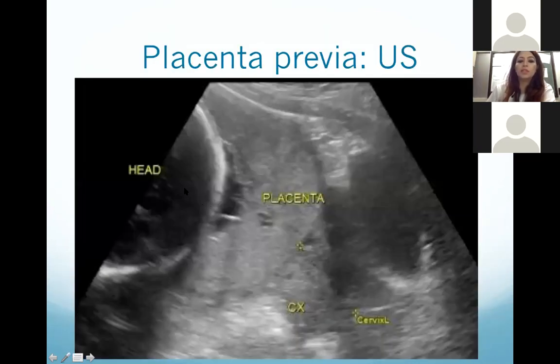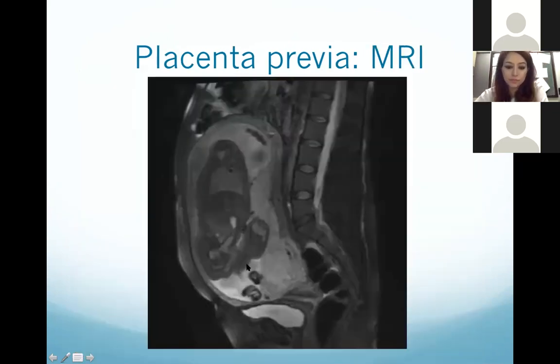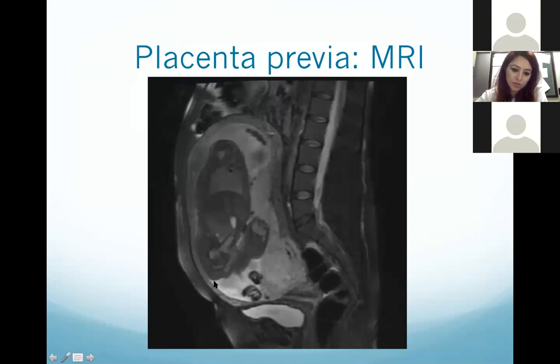Here you can see the fetal head in cephalic position, the cervix, and the placenta covering the entire cervix — this is placenta previa. Grade 4 placenta previa covers the entire cervix. On MRI you can better appreciate this: here is the cervix, the enlarged uterus, and the placenta as the white area covering the entire cervix and the os.